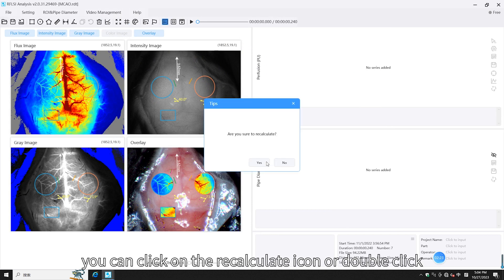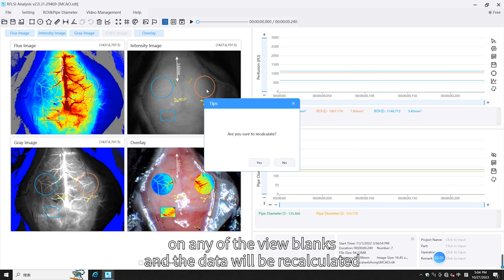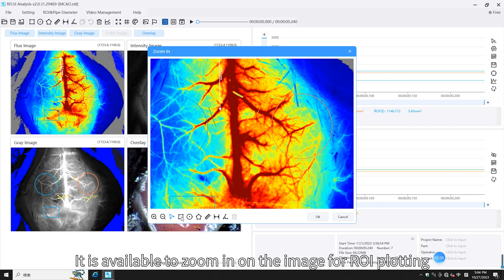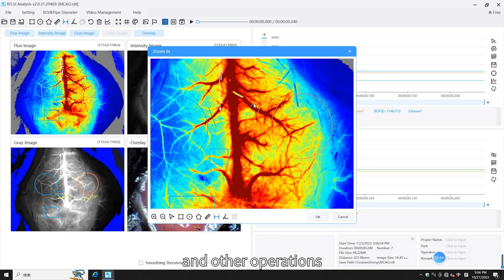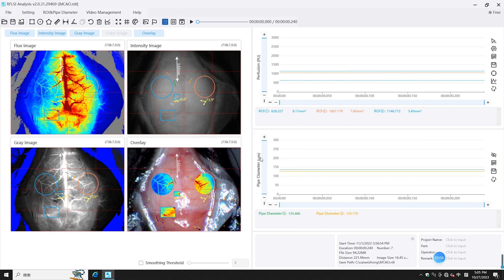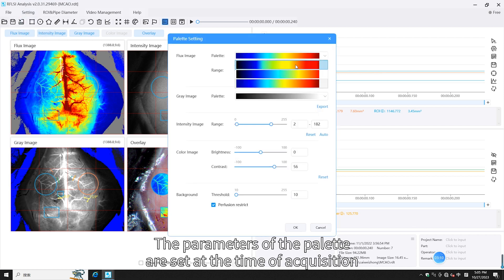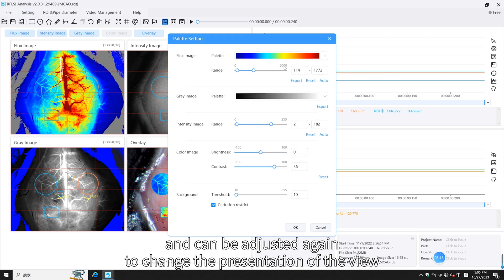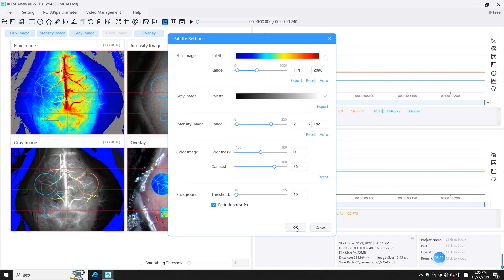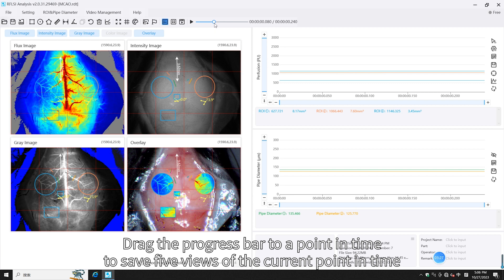Once the ROI is plotted, you can click on the recalculate icon or double-click on any blank in the view and the data will be recalculated. It is also possible to zoom in on the image for ROI plotting and other operations. Grid line specifications can also be modified. The palette parameters set at the time of acquisition can be adjusted again to change the presentation of the view without changing the data. Drag the progress bar to a point in time to save five views of the current point in time.